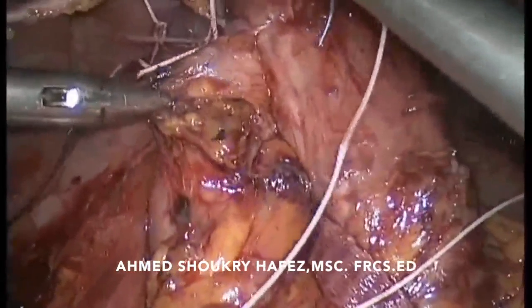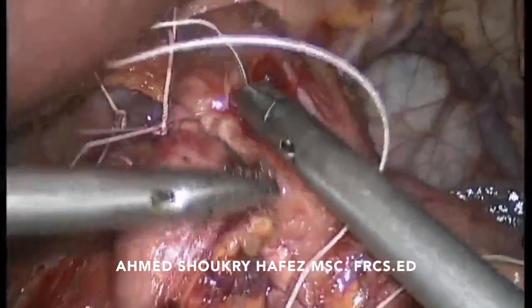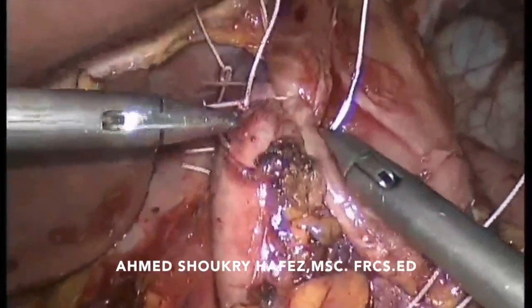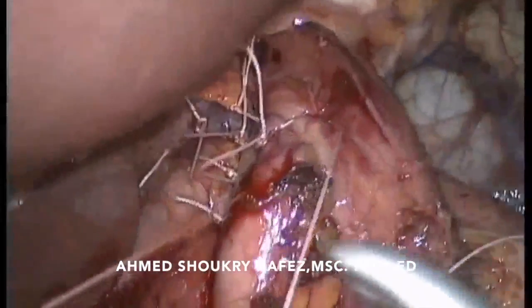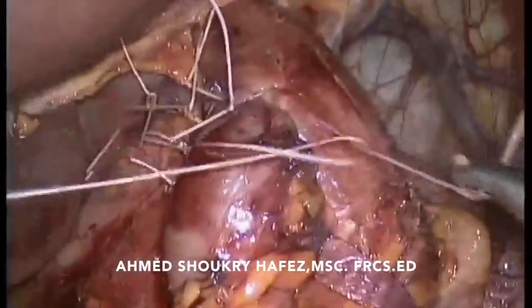The differences between the Nissen fundoplication and the Toupet are: 1. The fixation of the wrap posterior to the crura. 2. It's a 270 degree wrap, not a 360 degree wrap.